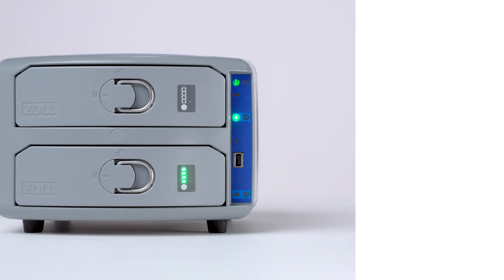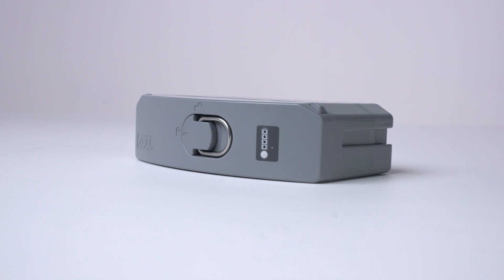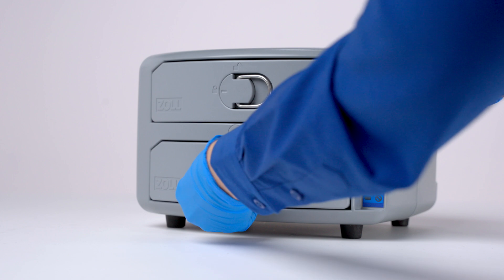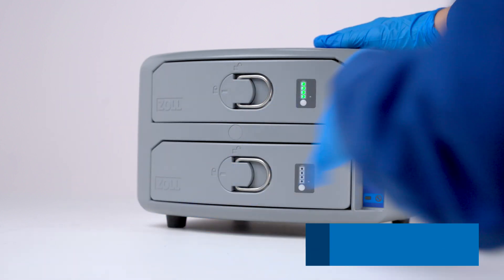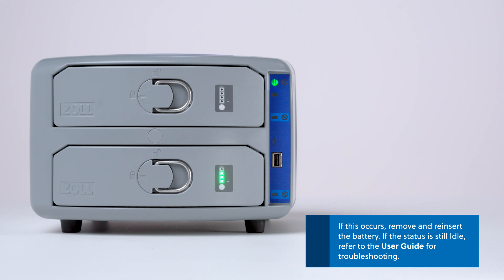Once it is fully charged, you may leave the battery in the charger, install it in the platform, or store it in a cool, dry place for future use. If the battery alert indicator illuminates, note that the battery charger was unable to charge the battery, or the battery has failed the measurement cycle. If this occurs, remove and reinsert the battery into the charger. If the alert indicator remains illuminated, note the battery serial number and contact technical support. If neither the battery charge status indicator nor the battery alert indicator illuminates, the battery charger is unable to recognize the battery.